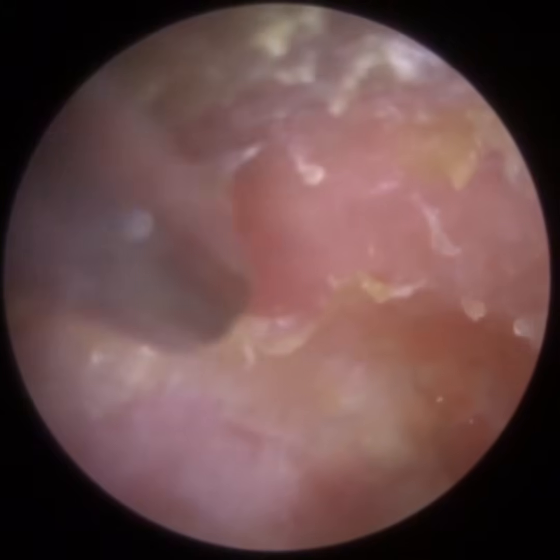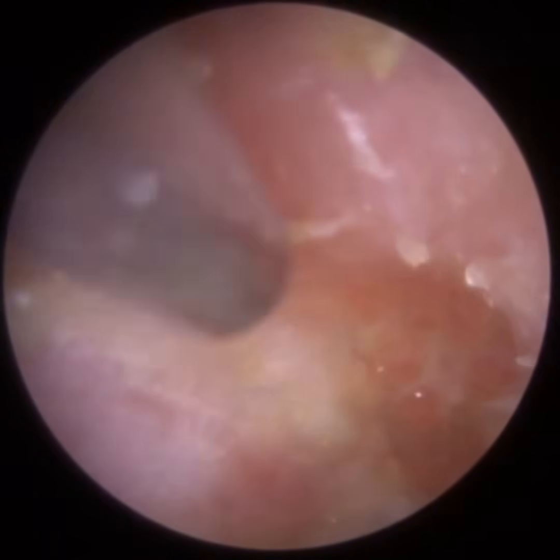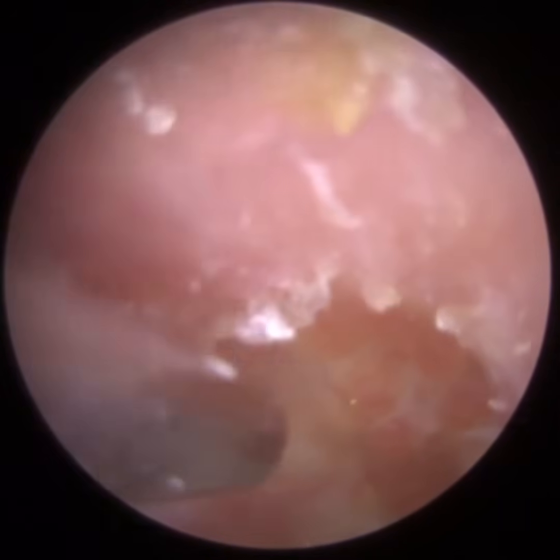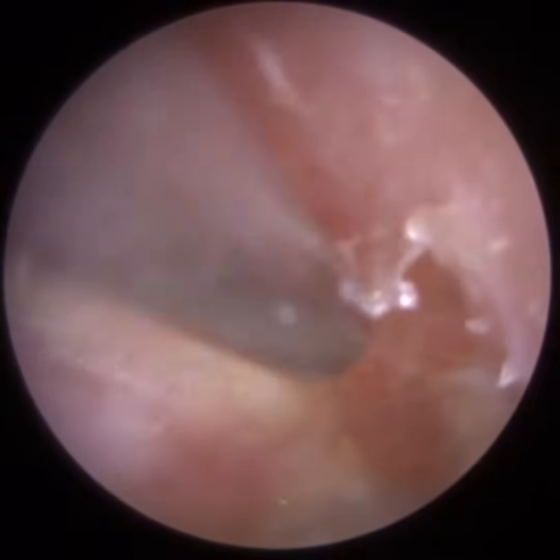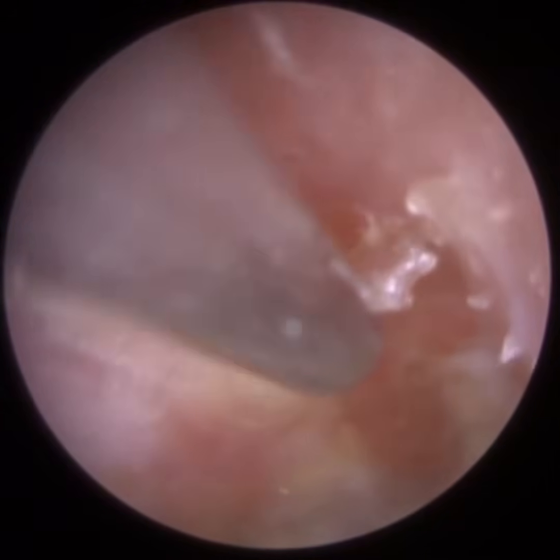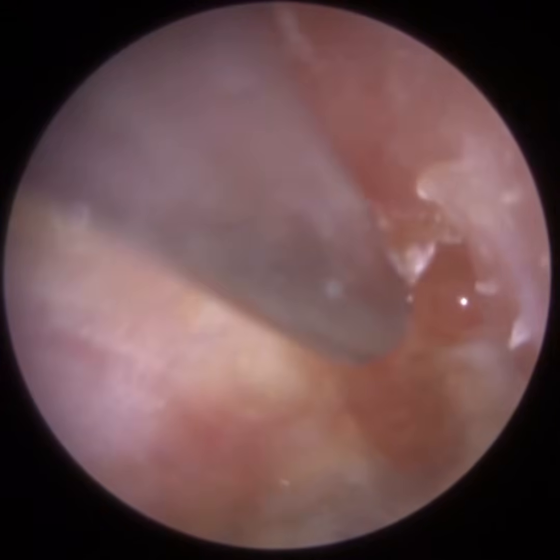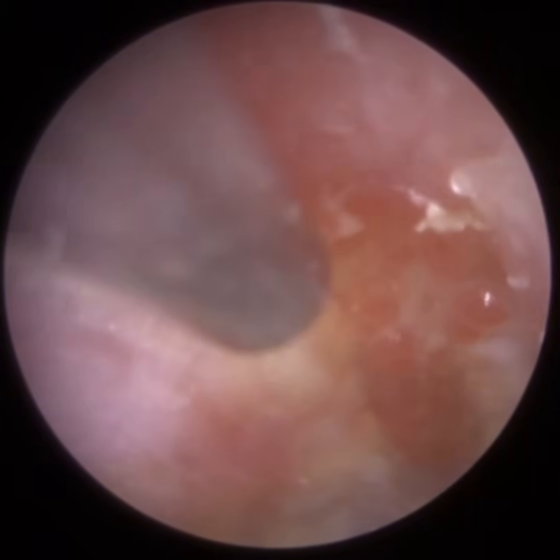So I've just reattached the fine end gauge, approach the skin on the roof of the ear canal, and we're going to peel it downwards off the eardrum, hopefully, as much as we can anyway. Now sometimes the skin is half dead, it's semi-shedding, so it's dying, but it's not yet dead, and it therefore still has strong adhesions to the eardrum, so it's just not quite ready, and we have to accept that. We don't continue.